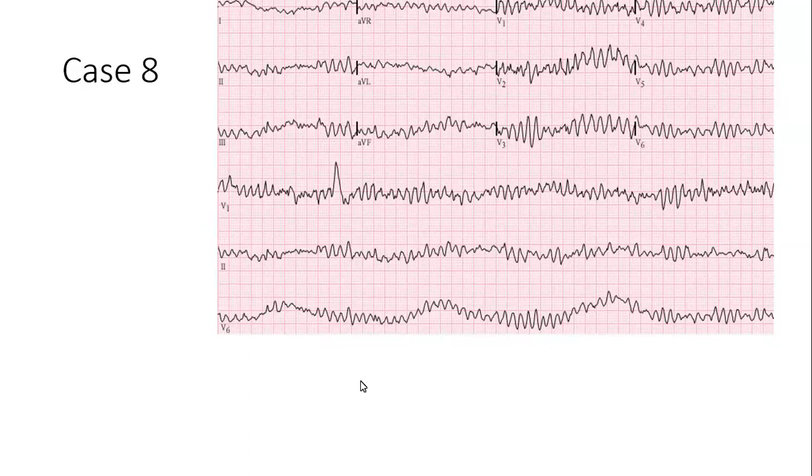But okay, a defibrillator, remember, delivers electrical energy to the heart. So the goal, like we said before when we were explaining synchronization, is to depolarize the myocardium completely, with the aim that this will revert it to a sinus rhythm. So a defibrillator has to be able to deliver the electrical energy. It has to have some form of power supply.